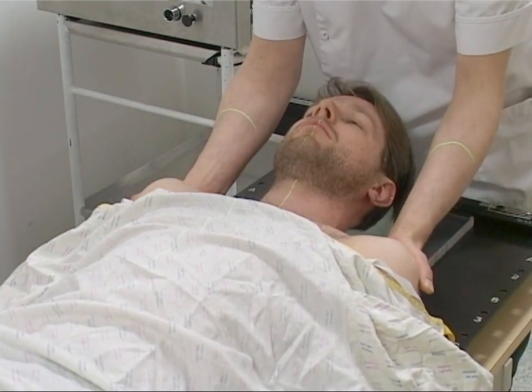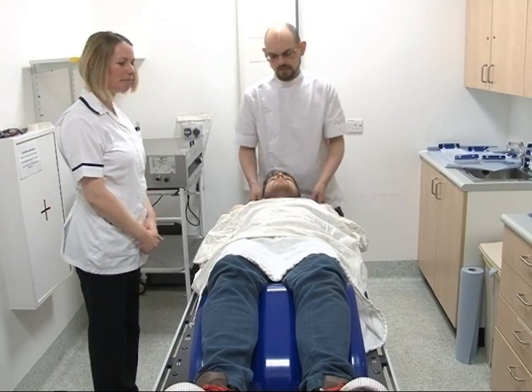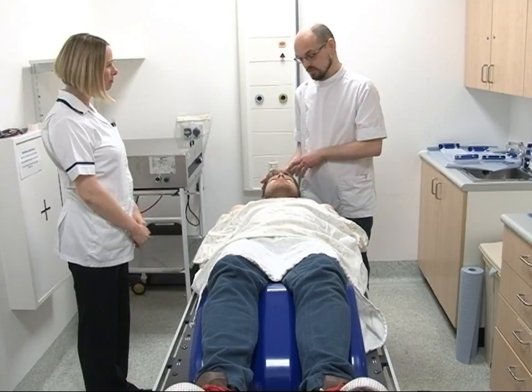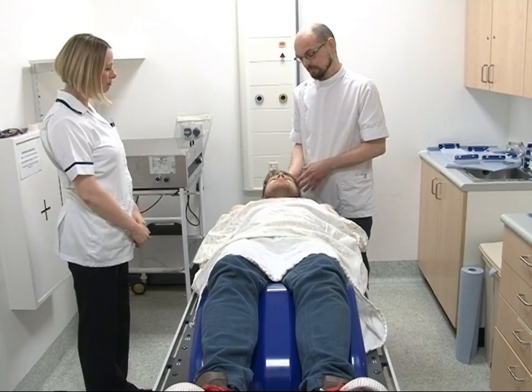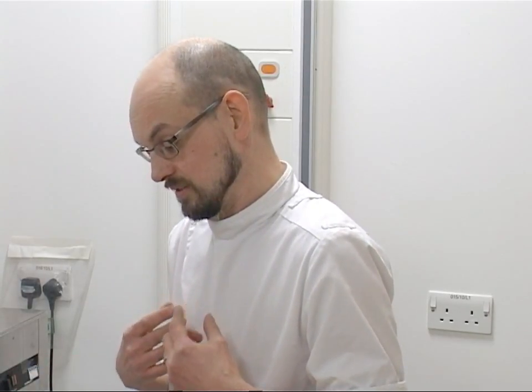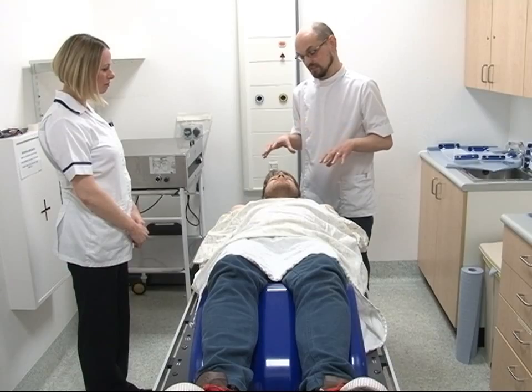The Mould Room team will take a few minutes getting you into the correct treatment position. The plastic will be taken out of the warm water and dried off. It is important that you let the Mould Room team know if you do not think you will be able to stay in the treatment position for about 20 minutes, or if you feel any pain or discomfort at this point.